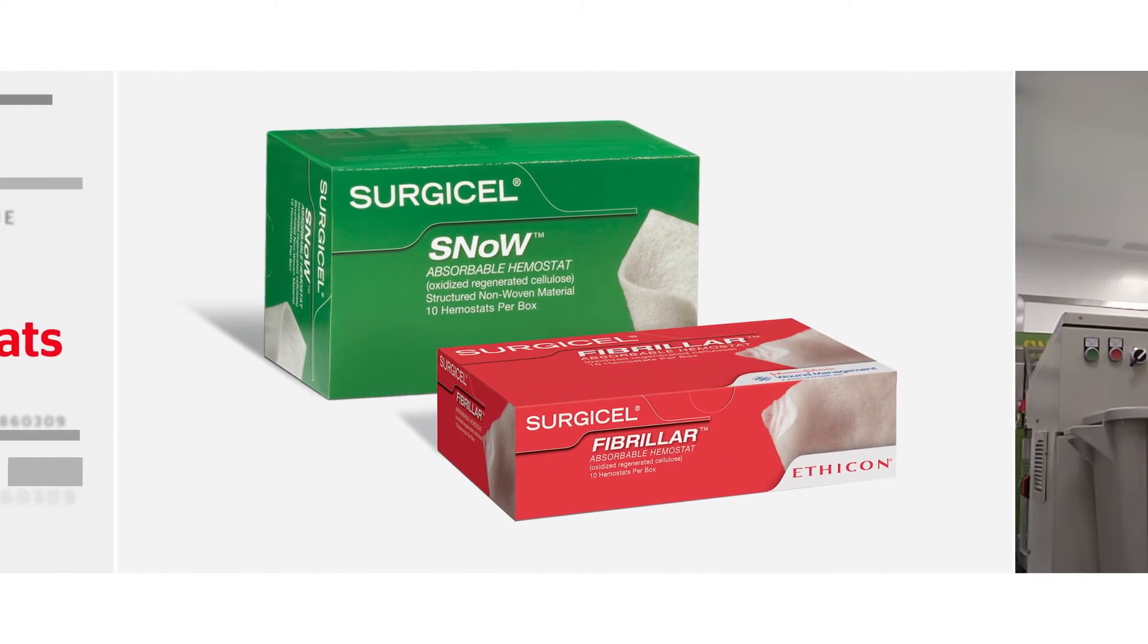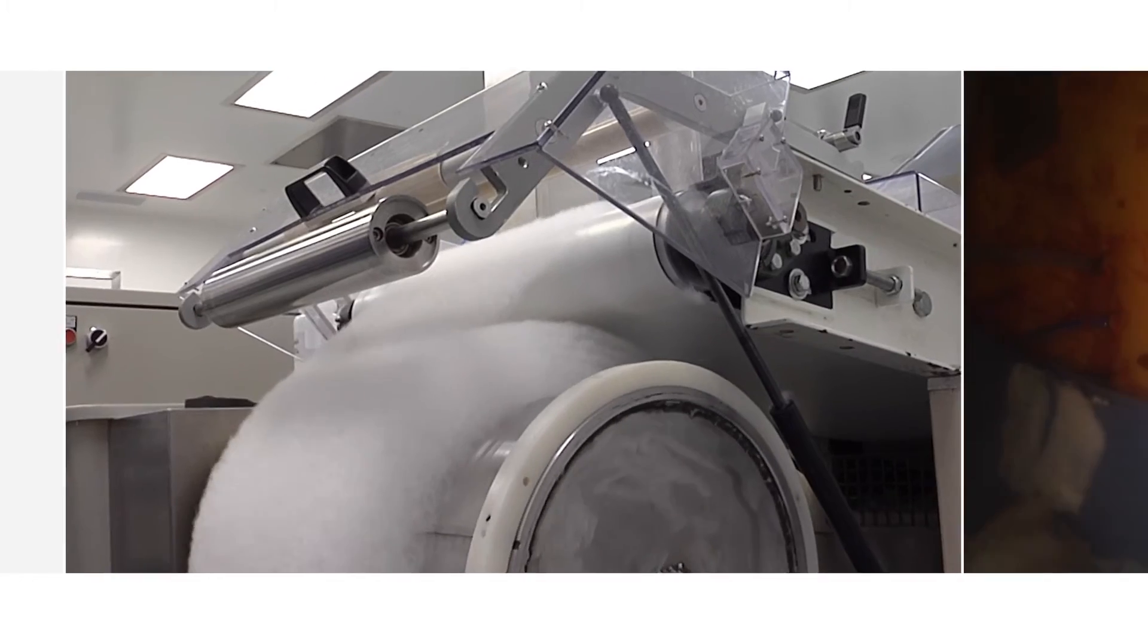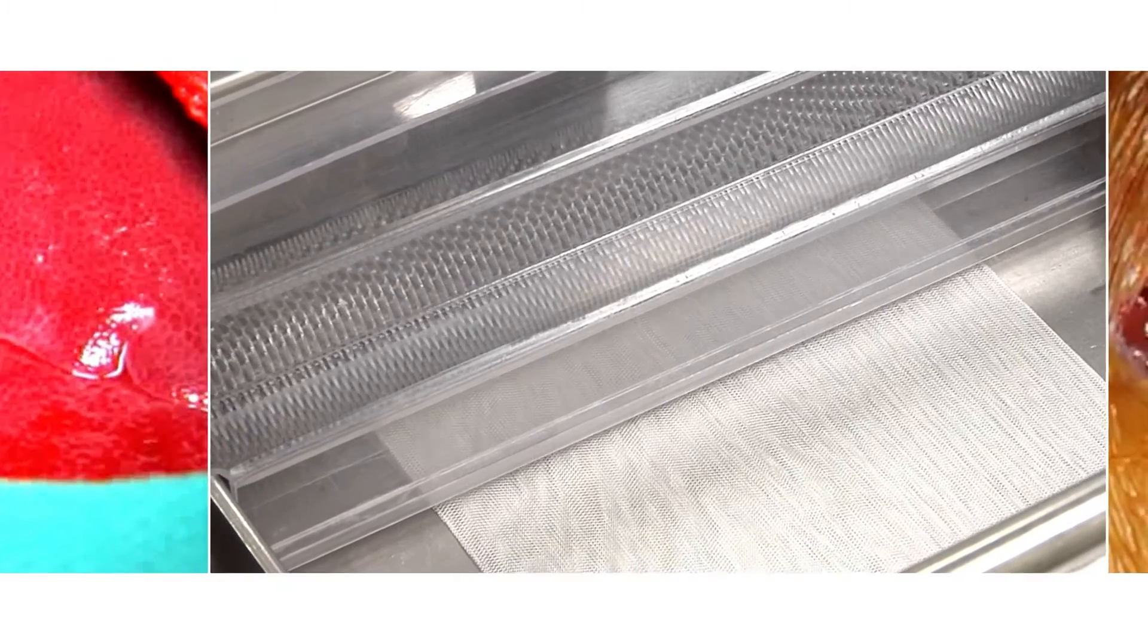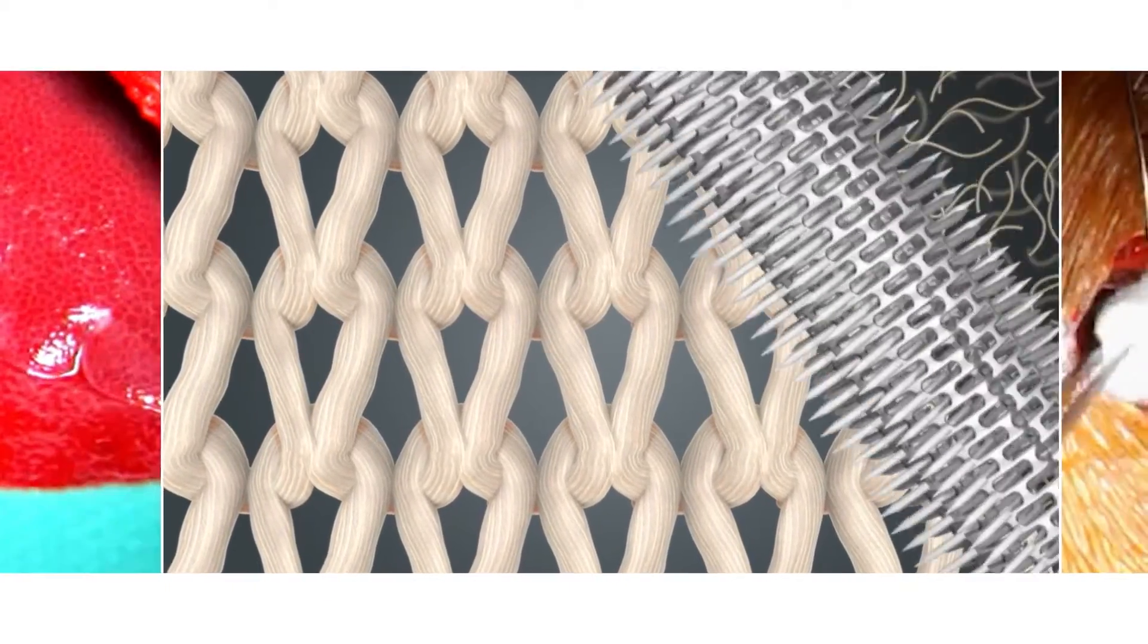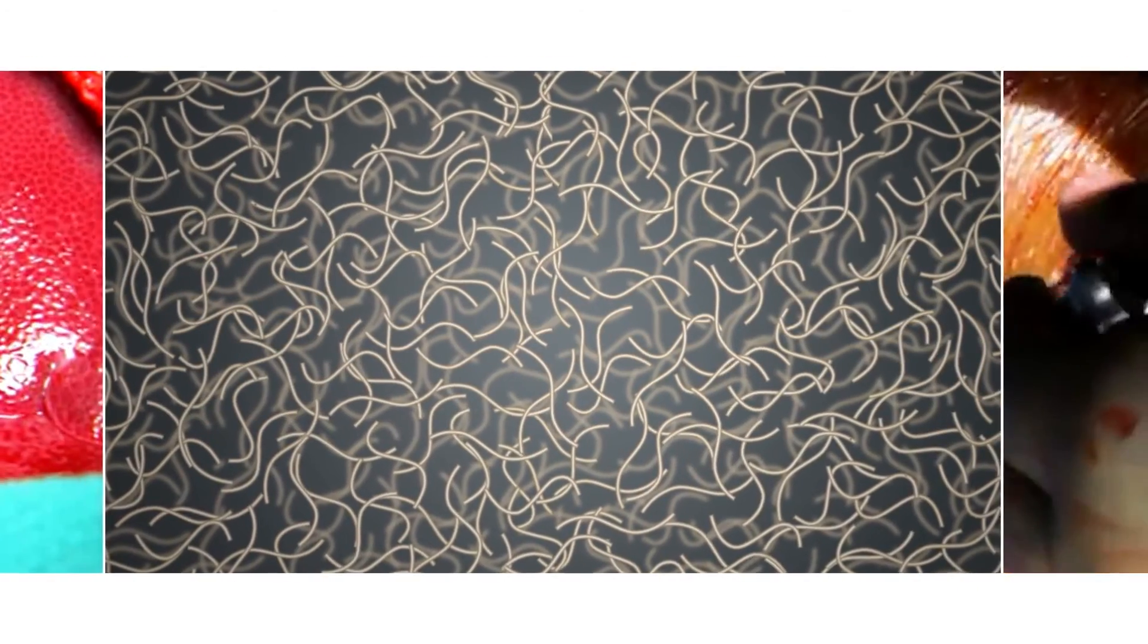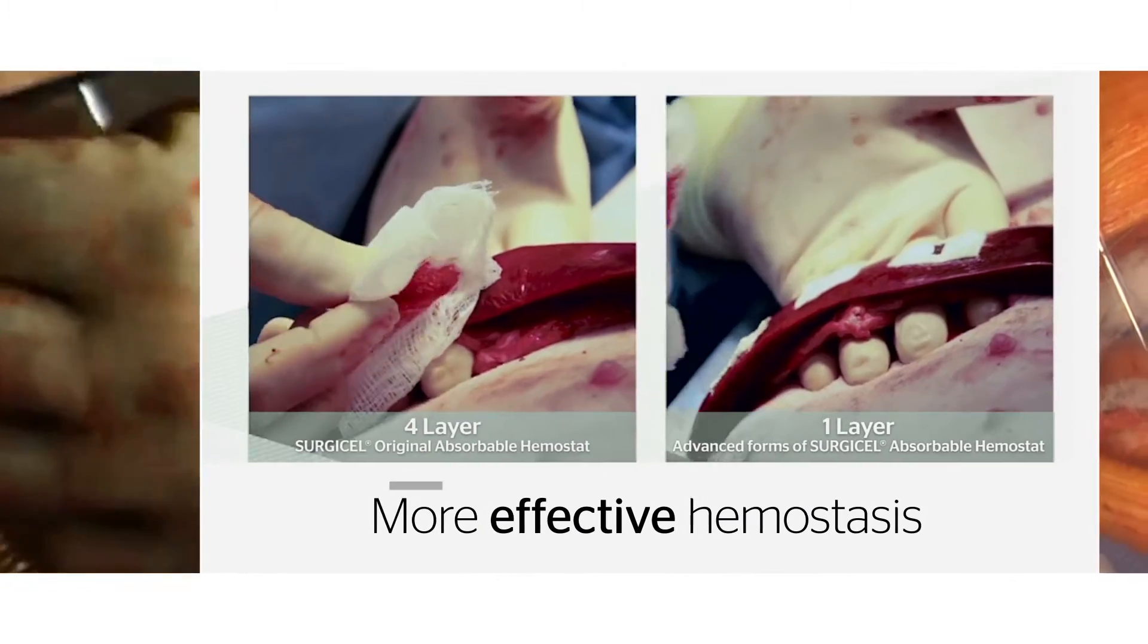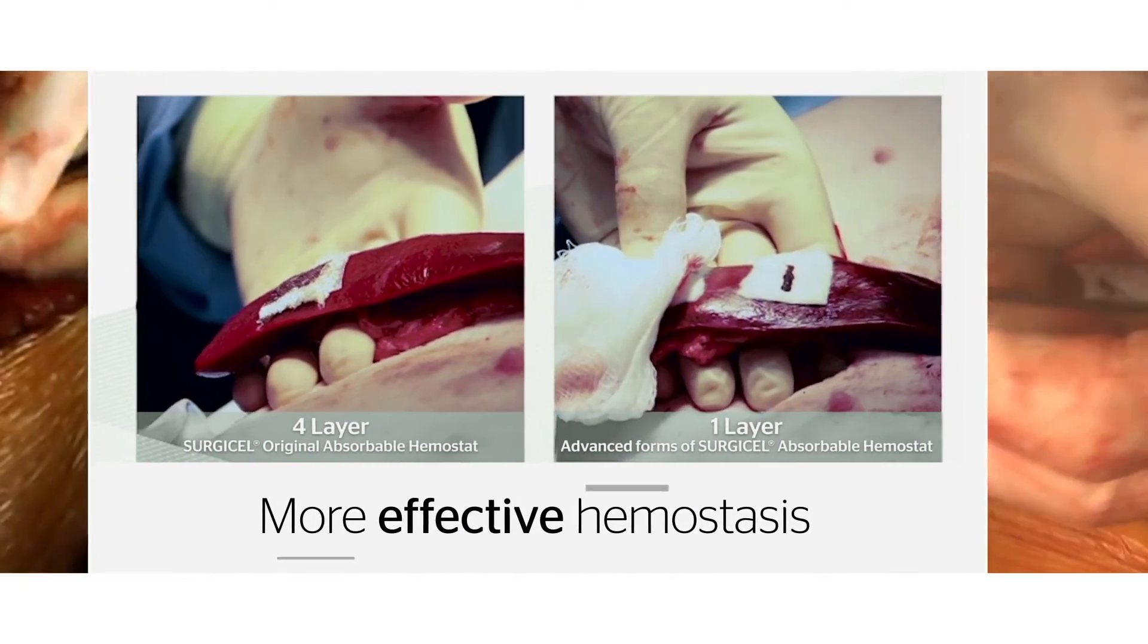Surgicel Snow and Surgicel Fibrillar are specially processed to increase hemostatic capacity and improve handling compared to Surgicel Original. First, Surgicel Original is broken down into individual ORC fibers. These fibers are then used to create non-woven materials with substantially more ORC per unit area. With more ORC available to affect hemostasis, just one layer of Surgicel Snow or Surgicel Fibrillar is more effective than four layers of Surgicel Original.